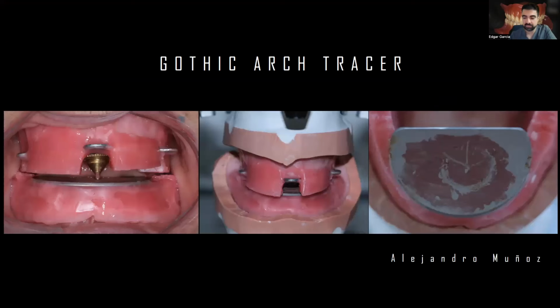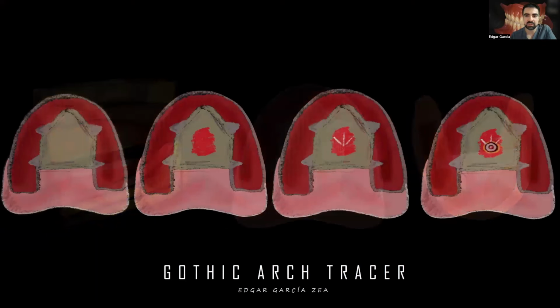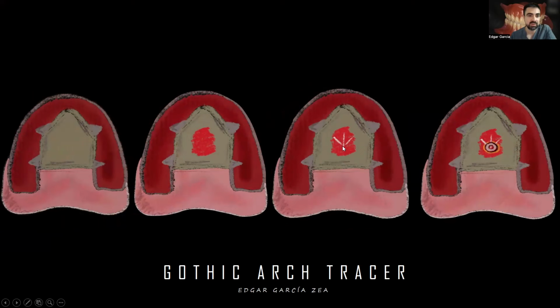This is a conventional Gothic arch tracer, as you told, this is a flat plate, okay, and this is the tracing. This is the same concept that when we found this starting point, okay, we put this little circle to maintain, and to obtain, like when we are gonna do the centric registration. That's exactly what you're doing?